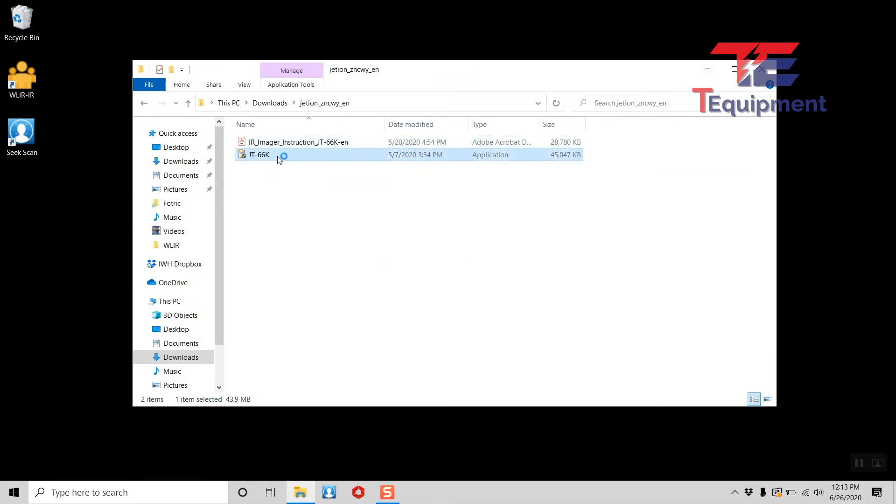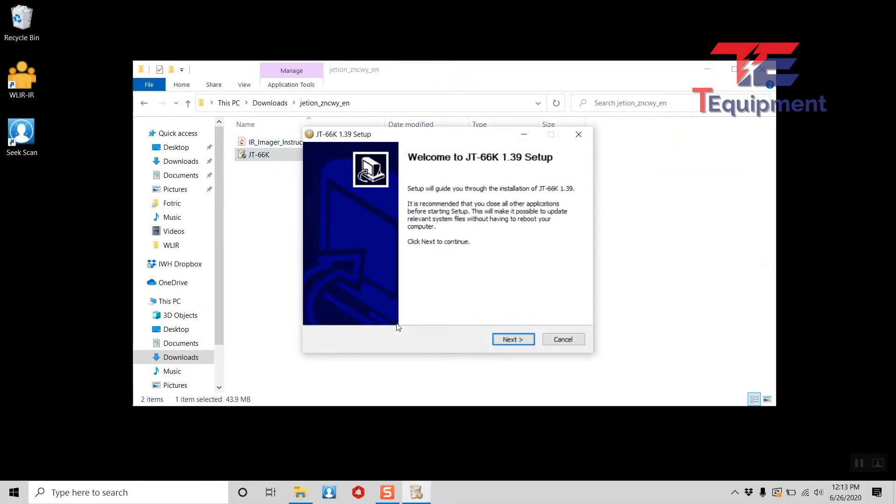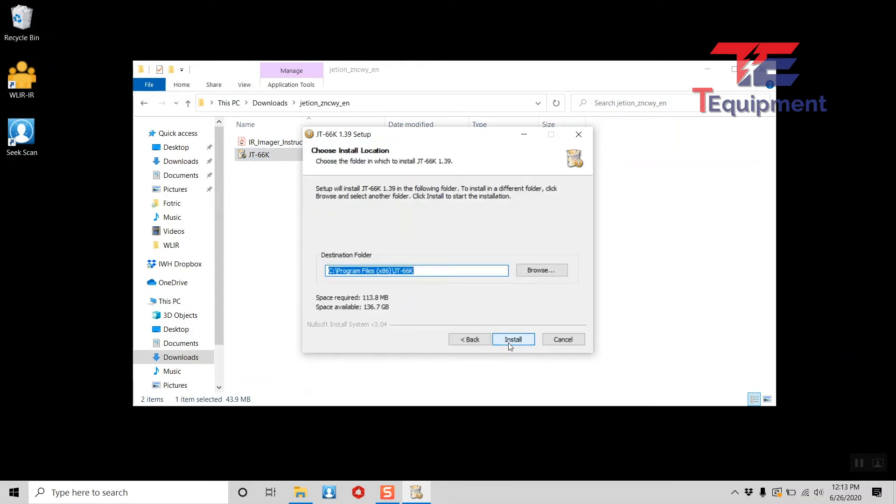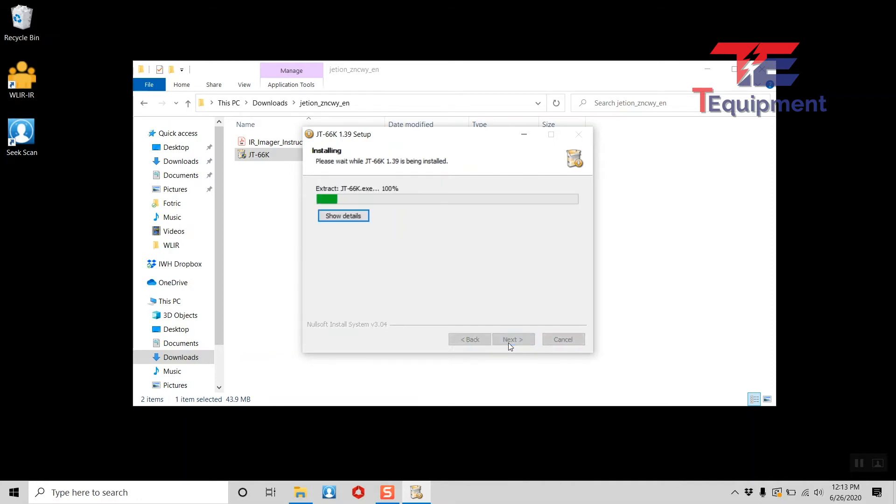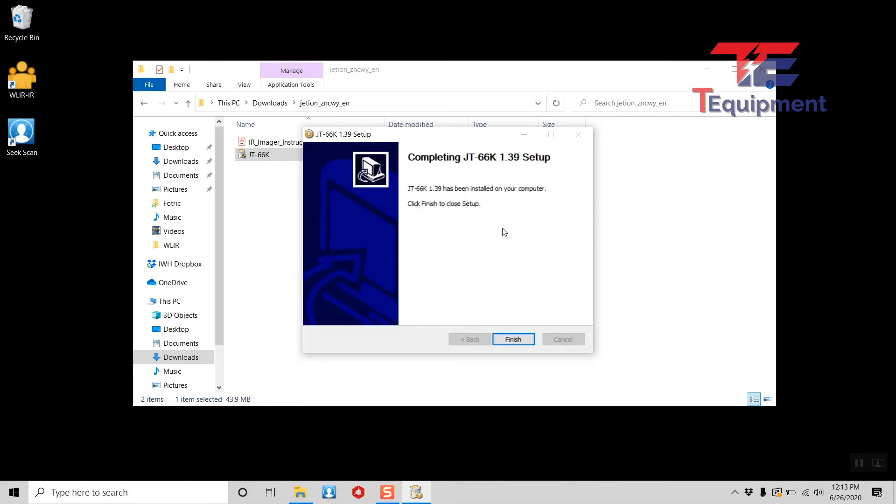Let's go ahead and install the software. The installation process for this is actually one of the simplest ones that I have looked at recently, apart from the other units here, the Seek Scan in particular. Jetion has done a nice job putting everything in here. Everything is digitally signed. There are no additional things you have to do or steps that are easy to miss. This one's all in one place.